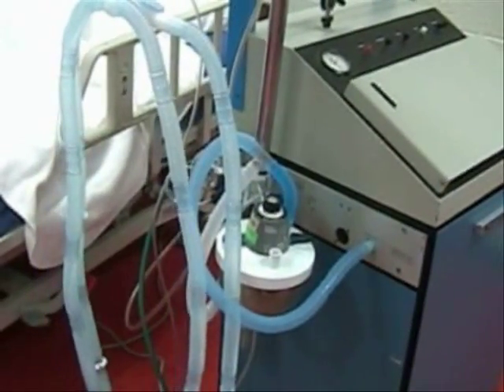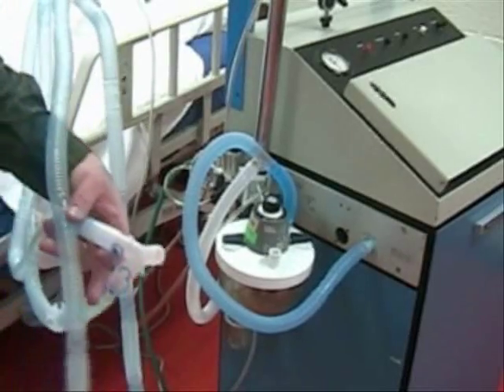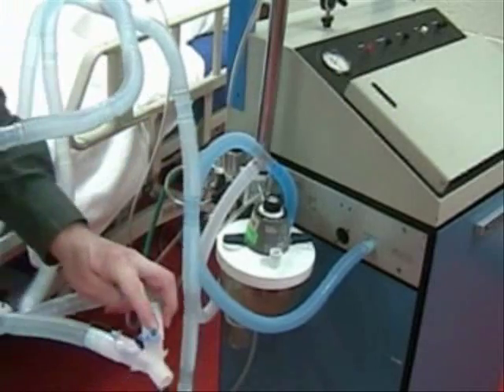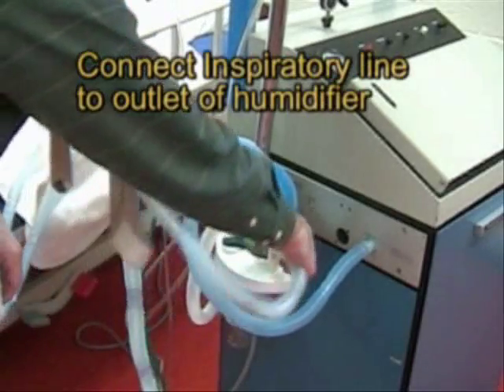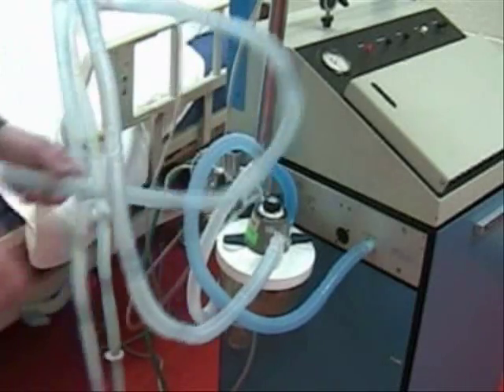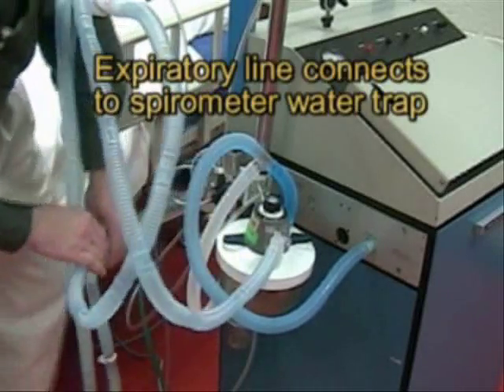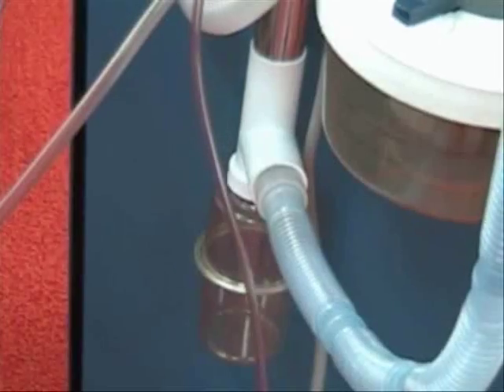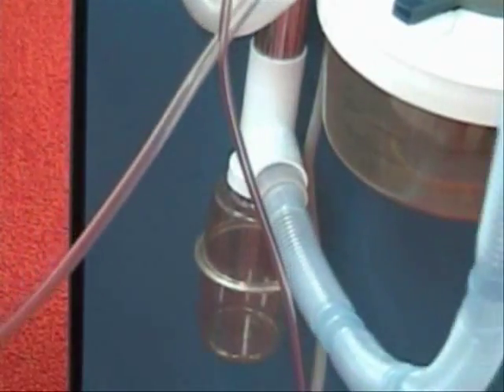Now let's take the inspiratory line. The inspiratory line is, as always, on the side of the female port where a temp probe would go. This inspiratory line goes to our humidifier, and the opposite line is our expiratory line. This end goes into the water trap on the spirometer and that goes down below. We can see the exhalation line going into the water trap and that goes up to the spirometer.